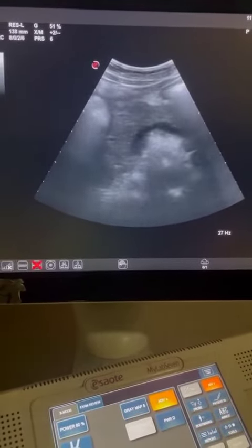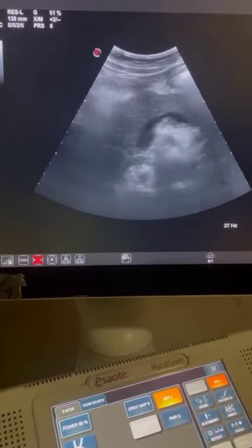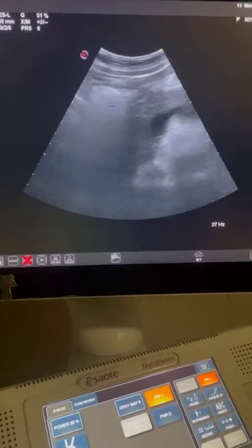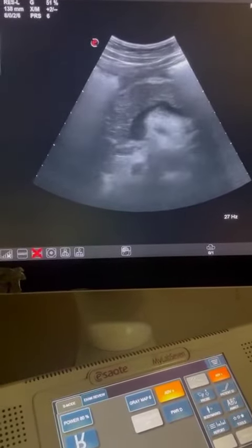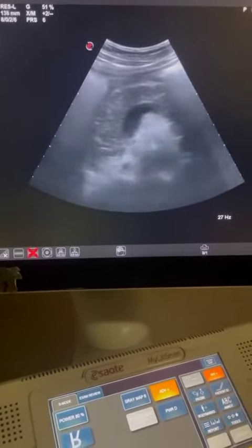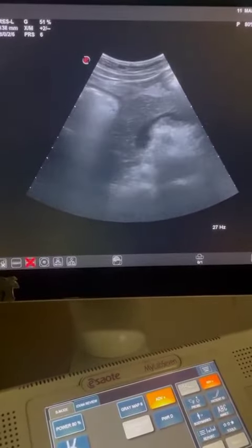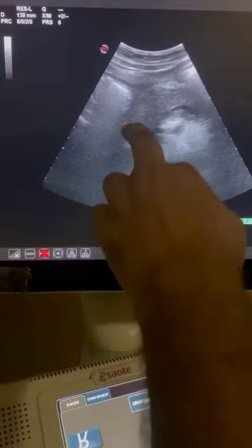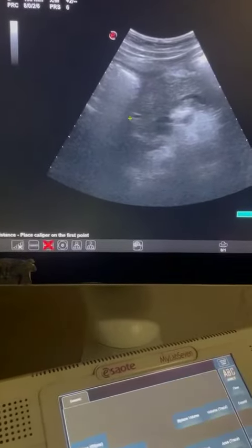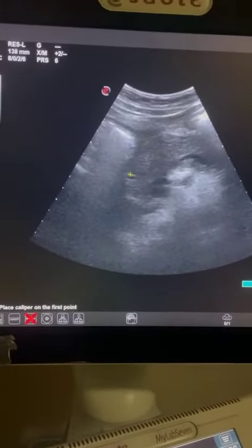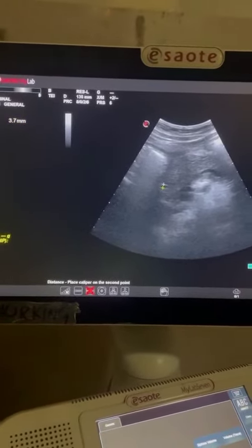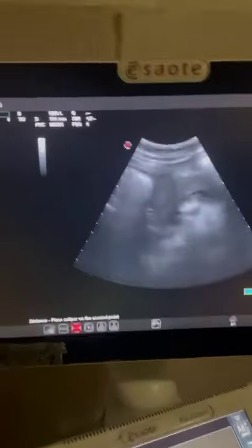I am focusing towards a clear cross-sectional view so you can see the findings well. Here you can see the pancreatic duct passing through the pancreatic head as shown by the finger, and it measures about 3.8 millimeters — a bit increased in size — which indicates acute pancreatitis.